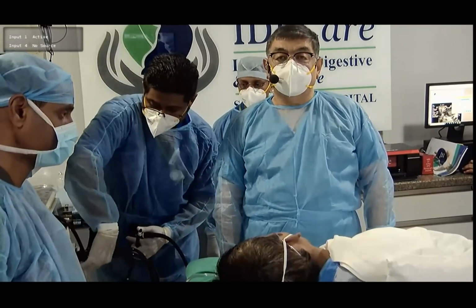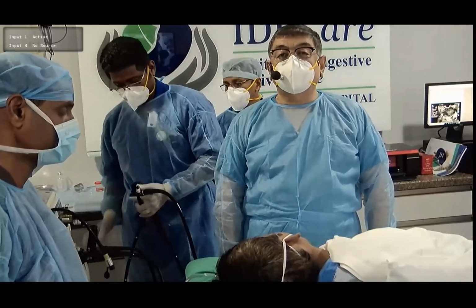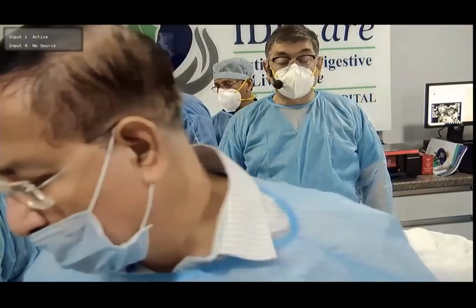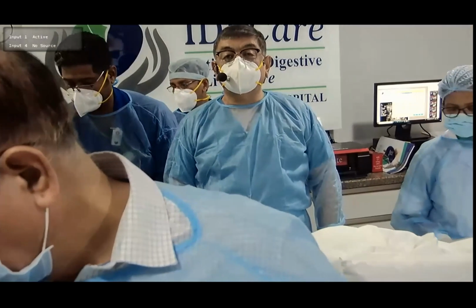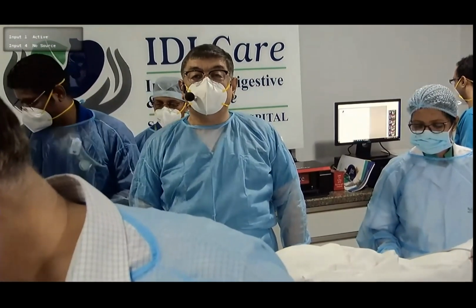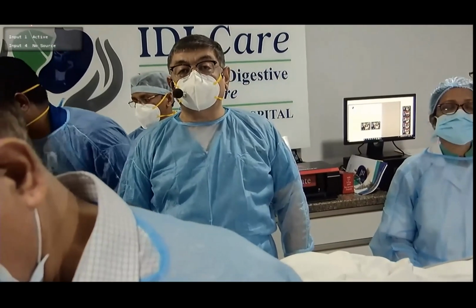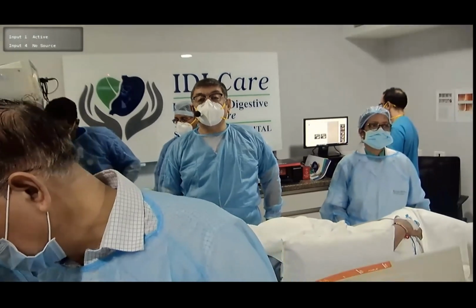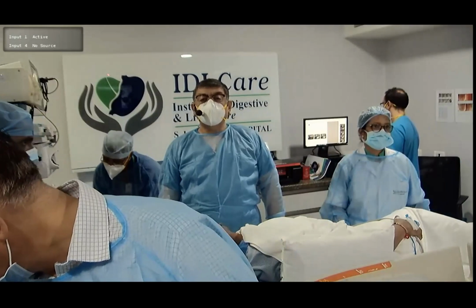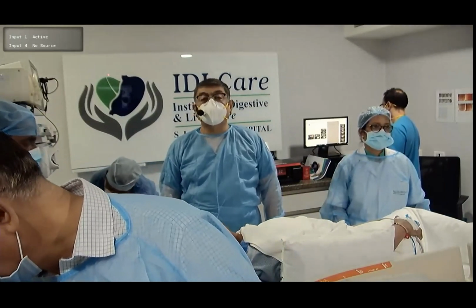The thing is, most of my patients do not have insurance. I have to think of cost. So contrast only to be used in patients in whom you are confused. You do not know where to take the biopsy from. And then yes, it is useful. Once you use a contrast, you will pick up these areas and you target those areas for biopsy. Elastography, I am not a good fan, but contrast, yes, it is useful in a select group of patients.